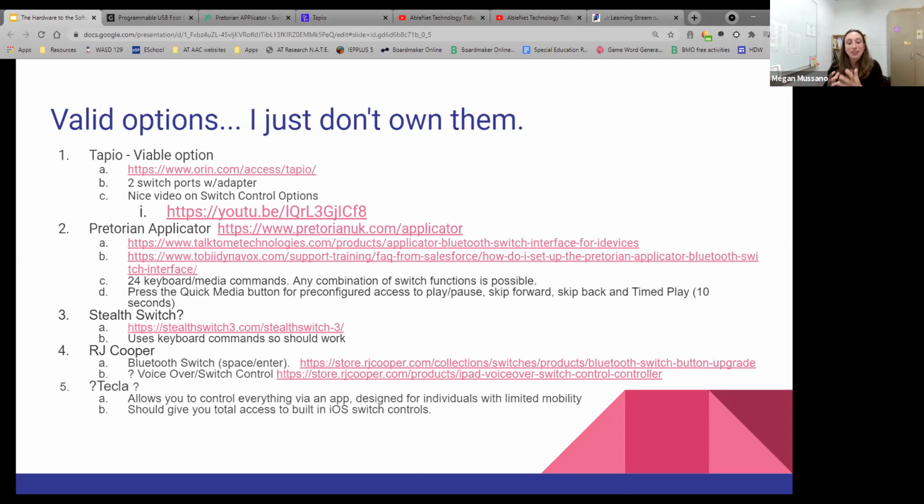I've always liked that because since it's a Big Mac, my CVI students can hear it. They hear the click, they feel the click, they're used to that click, but they also get that really strong auditory feedback of whatever it is that you record on the Big Mac or the Step-by-Step along with activating. So that's a way around it.